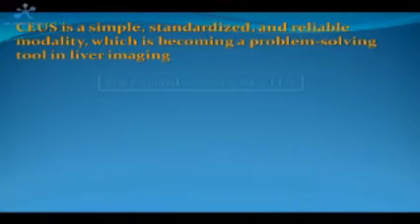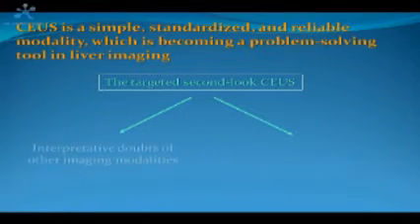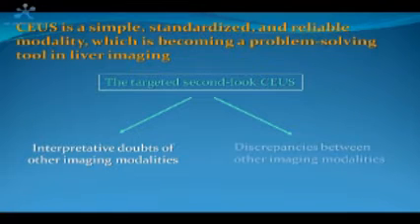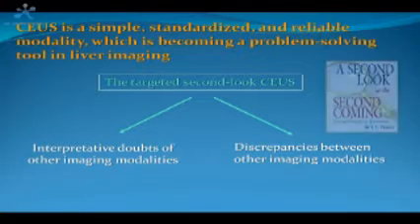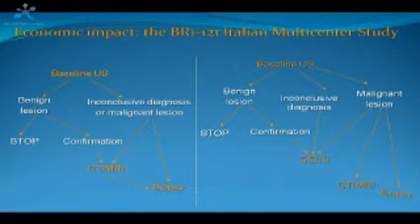So from this point of view, CEUS is a simple and now standardized modality, which is becoming a problem-solving tool. We really frequently employ it as a second look modality in case of doubts or discrepancies between other imaging modalities in our Cancer Institute.